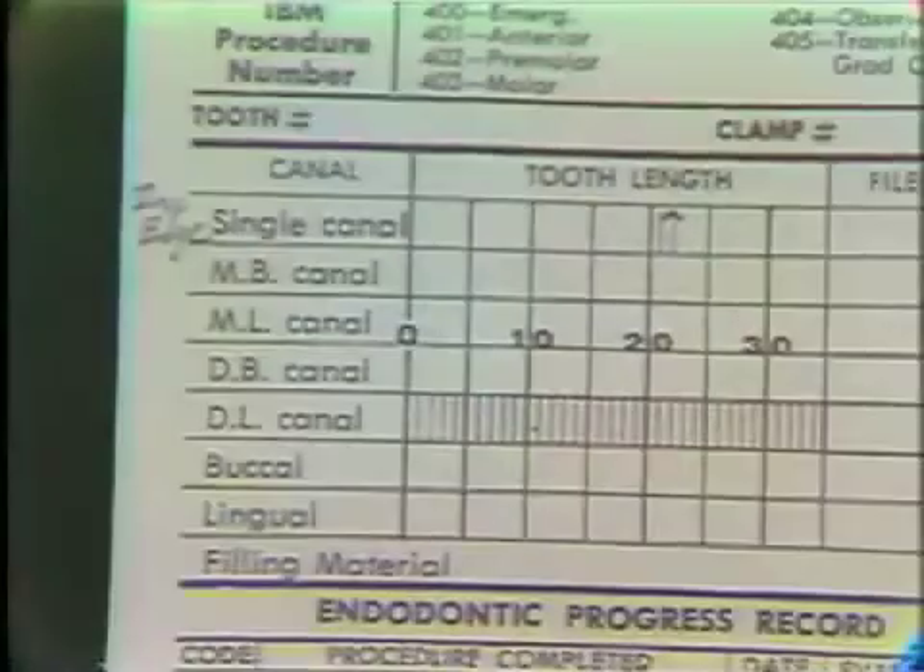This radiograph goes along with packet number two. The packet was marked to indicate the length to which the file was originally inserted into the tooth. Record the adjusted, accurate working length, and the reference point, which was the incisal edge. Your chart should look like this.